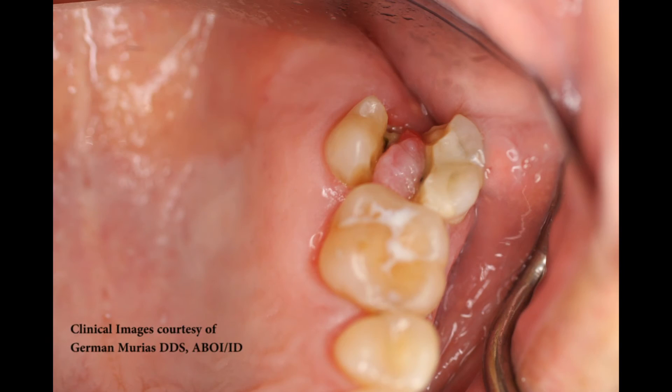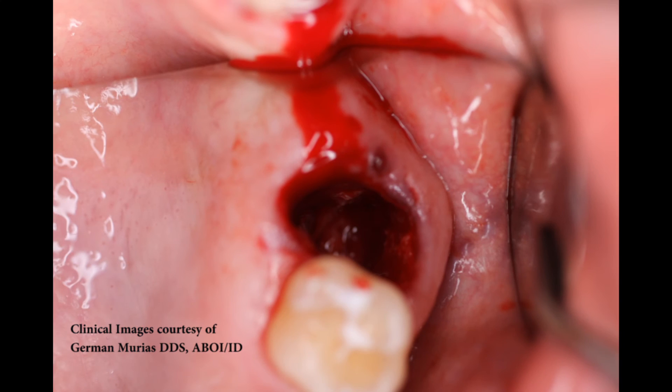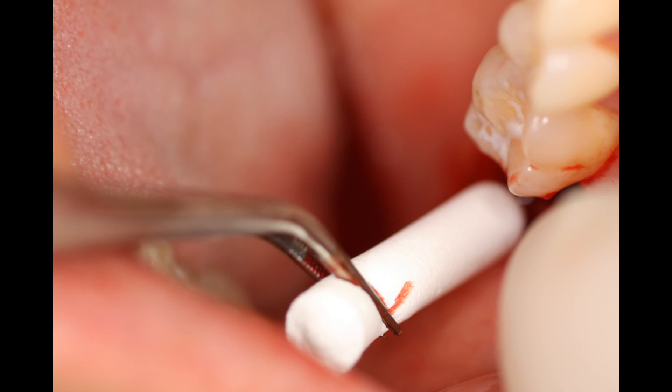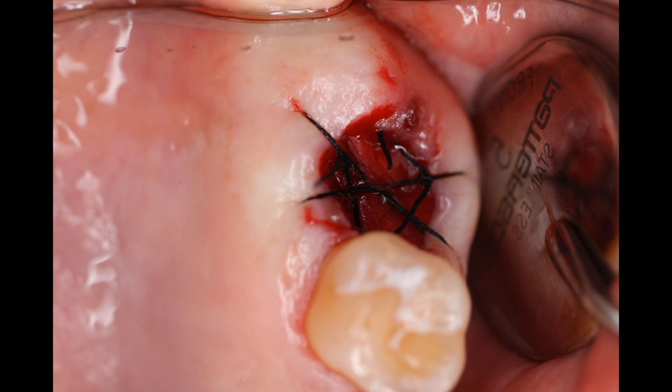In this clinical example, tooth number 15 is set to be extracted and the socket was thoroughly debrided to trigger the regional acceleratory phenomenon, commonly known as RAP. This procedure is known to stimulate bone formation and graft incorporation. Two slim Osteogen Bone Grafting Plugs were inserted and sutures were placed over top. Note that no membrane was used as there is no chance for particulate washout.